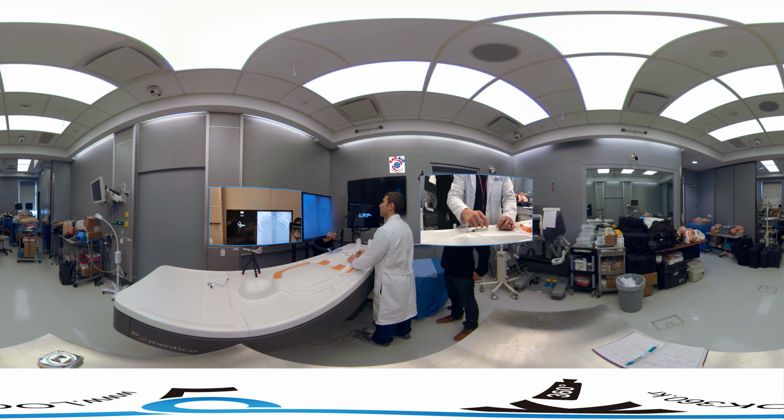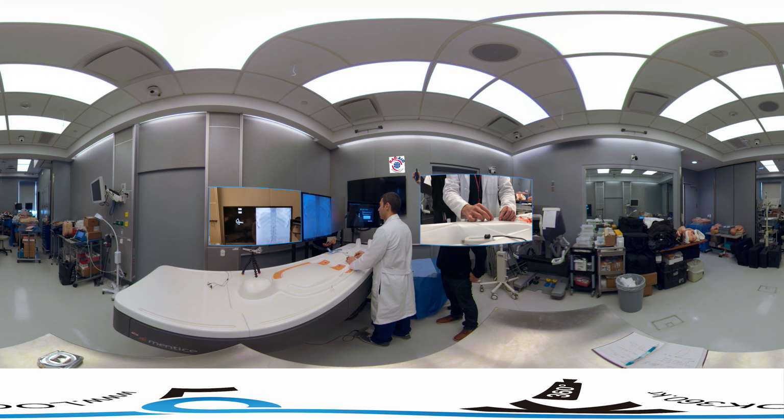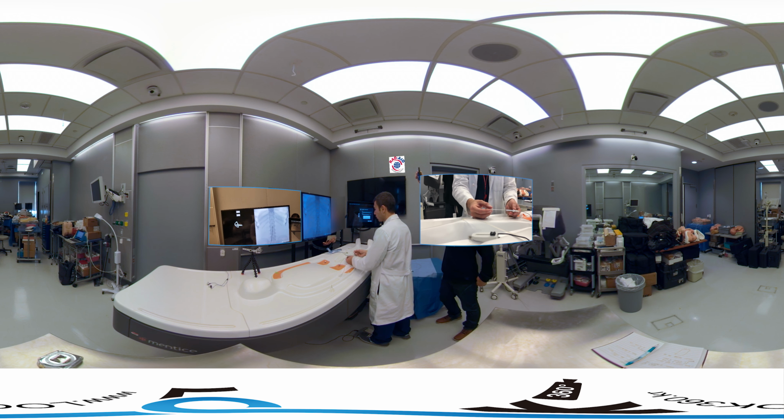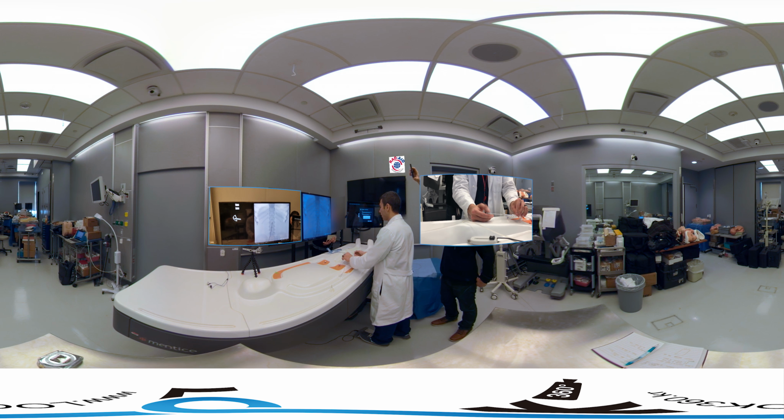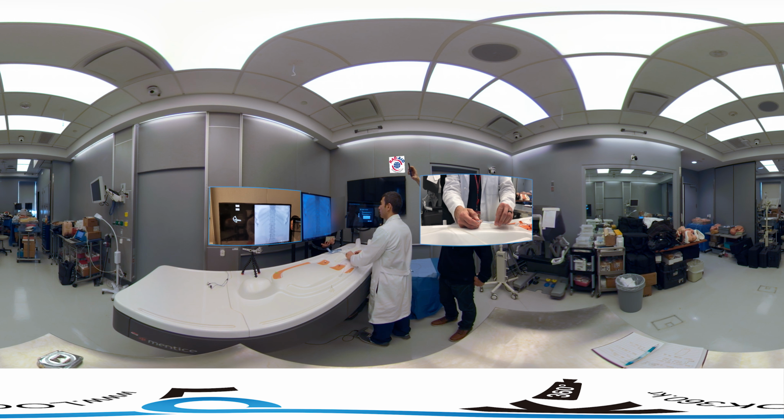The machine should recognize the filter as it comes up closer to the black mark. There we go. And we'll bring the filter tip to tip on our sheath. The way this is designed to work is that you hold your right hand steady and your left hand is going to unsheath the filter. So you're only going to move and retract with your left hand. The right hand holds this back part steady. And you unsheath the filter.